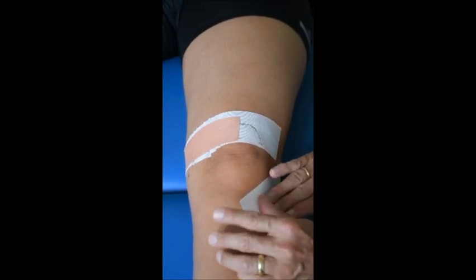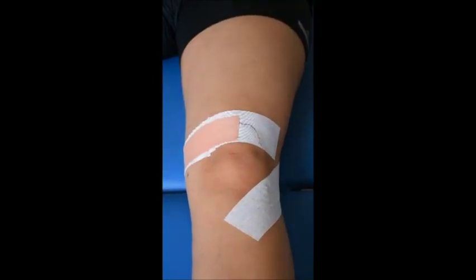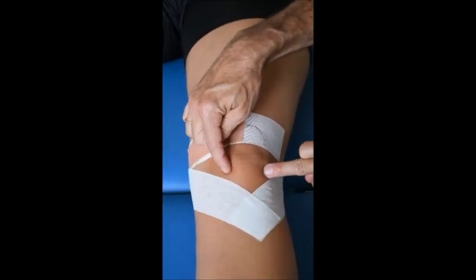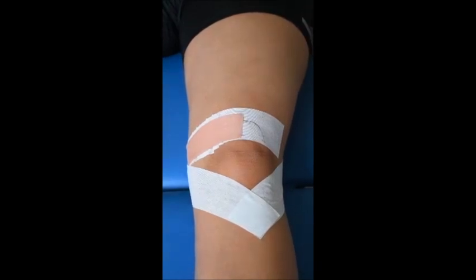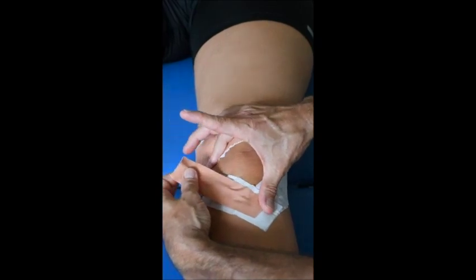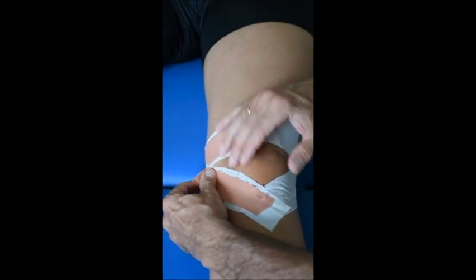We place the tape diagonally in this way, and the same we do it on the opposite side, on the medial side, in order to unload the fat pad on the medial side. We place 1 tape over the other. Make sure with the tape you're not squeezing the fat pad. Now, doesn't matter whether you start medially or laterally. It's important you start with the tape distally by the tibial tuberosity. Make sure you try to unload by approximating the tissue and by lifting off the fat pad.